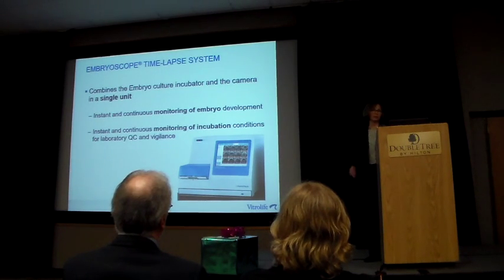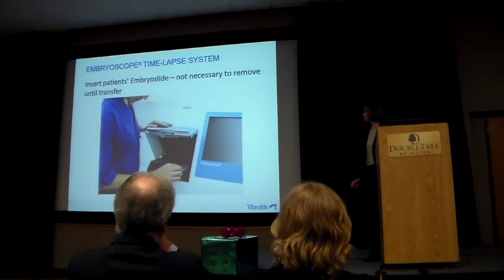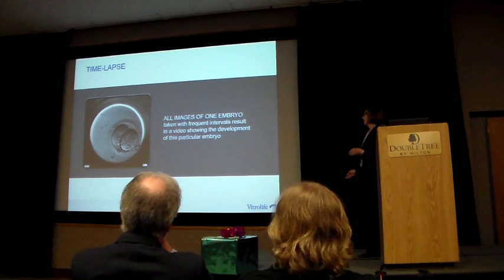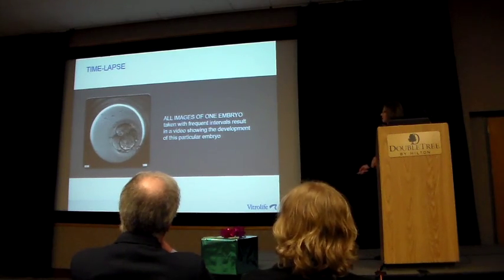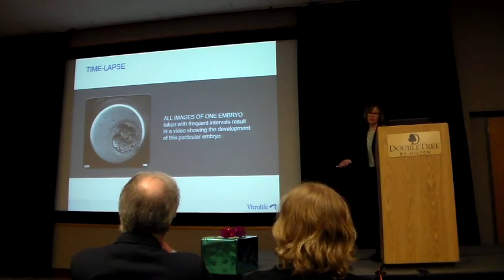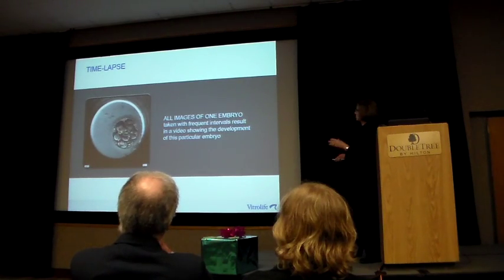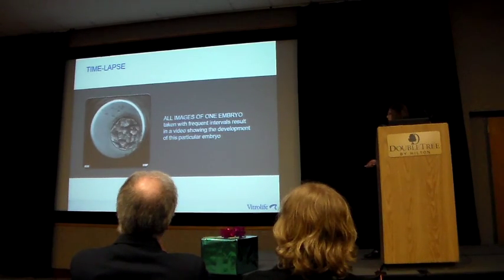It's never getting exposed to the stress that it could be if you were taking it in and out to get these images. This is just a brief little video just to explain. Everybody's seen time-lapse videos. They show it when there's a storm system moving across the plains. They show it constantly. So you know what time-lapse is, but this is just what we would see if we were to look.